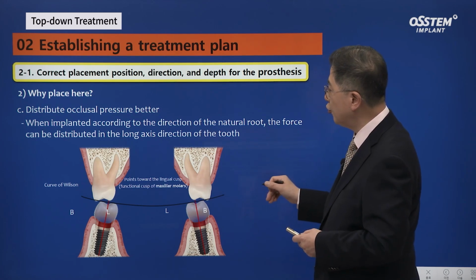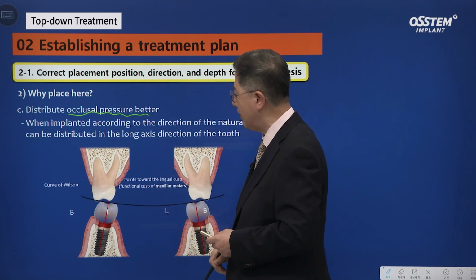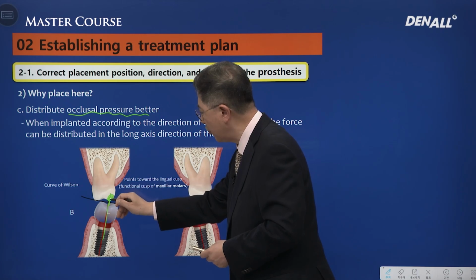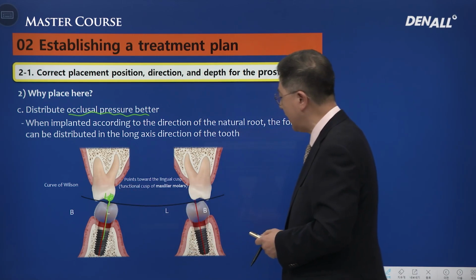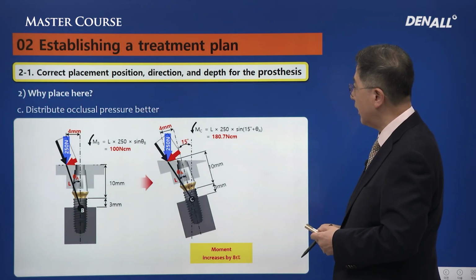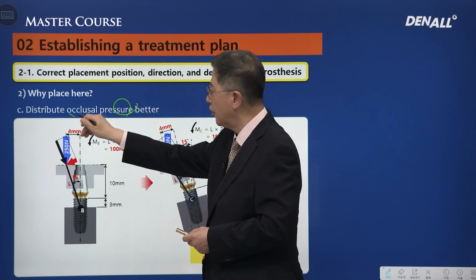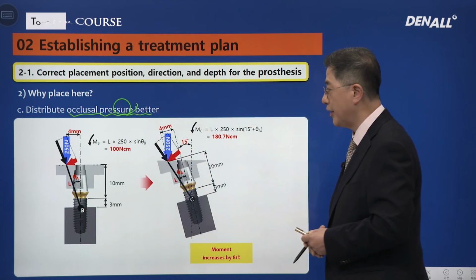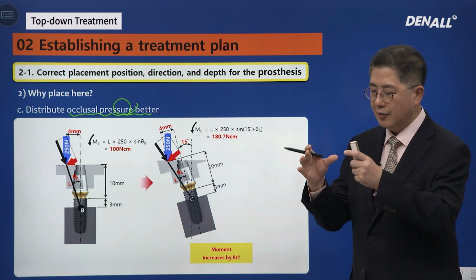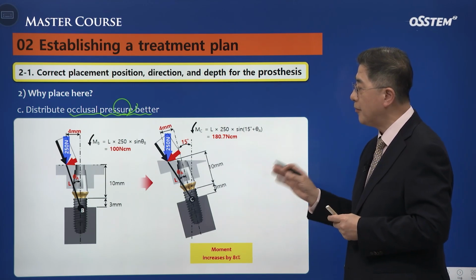When we look at the axis of the implant, the occlusal forces need to be distributed appropriately. The implant should be placed slightly inward from the palatal cusp tip. Like this. When cantilever occurs, such moment occurs, so we need to form occlusal table accordingly. In relation to the cantilever amount, I've talked about how the occlusal contacts should not be formed too far away from central axis. This is about the cusp angle.